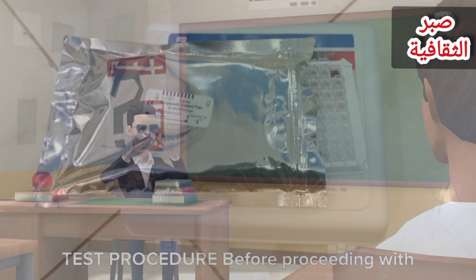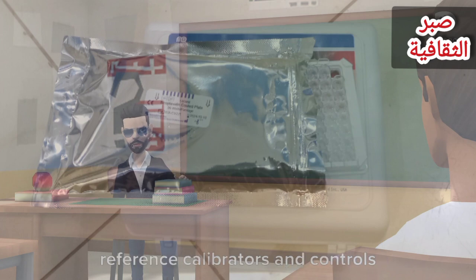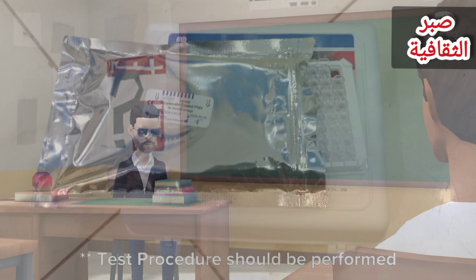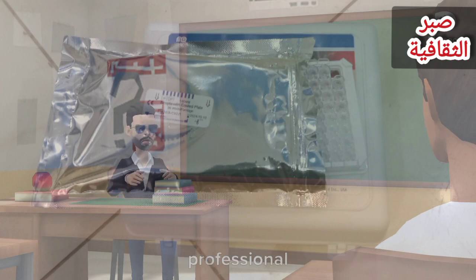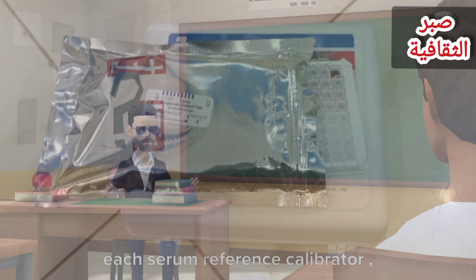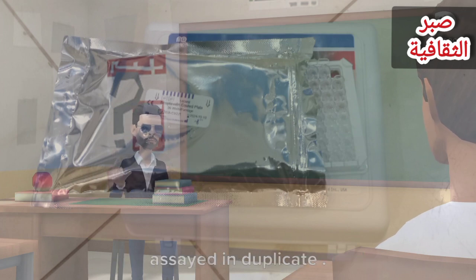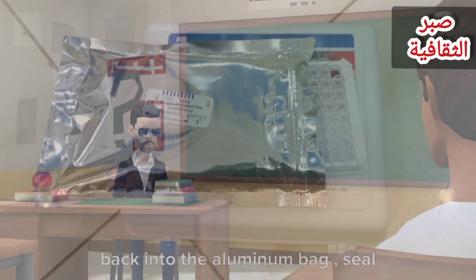9.0 Test procedure. Before proceeding with the assay, bring all reagents, serum reference calibrators, and controls to room temperature 20-27 degrees C. Test procedure should be performed by a skilled individual or trained professional. 1. Format the microplate wells for each serum reference calibrator, control and patient specimen to be assayed in duplicate. Replace any unused microwell strips back into the aluminum bag, seal and store at 2-8 degrees C. 2.